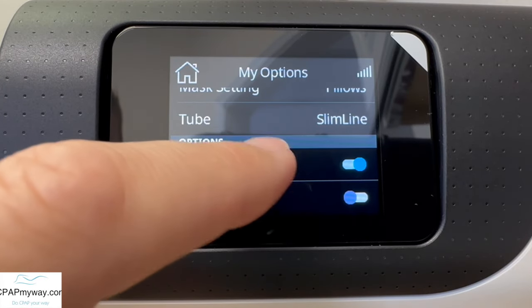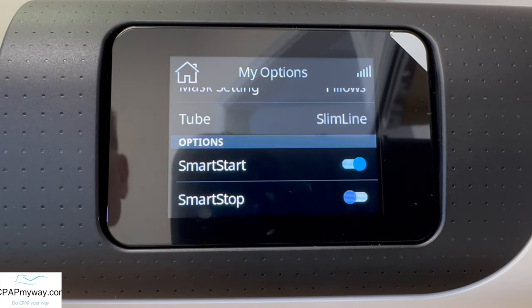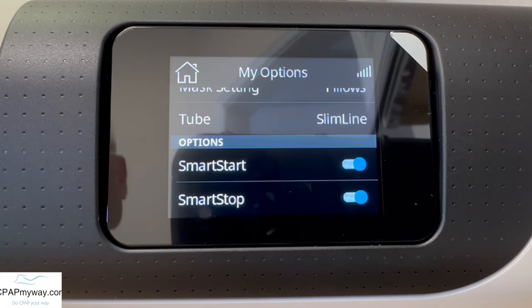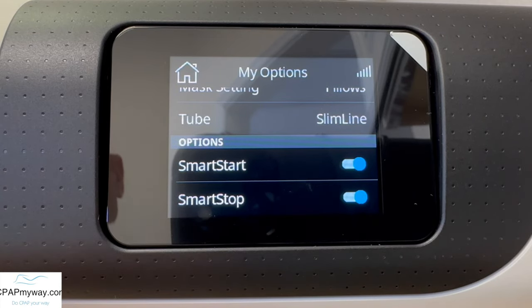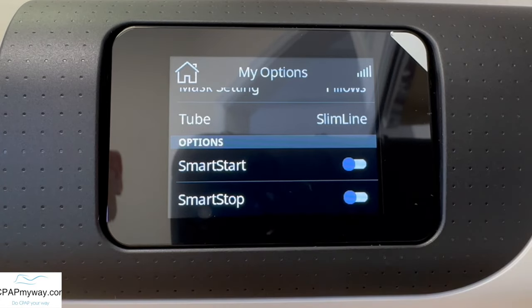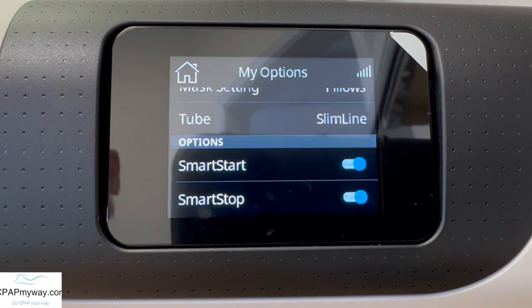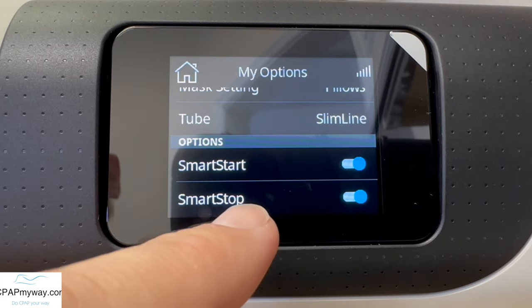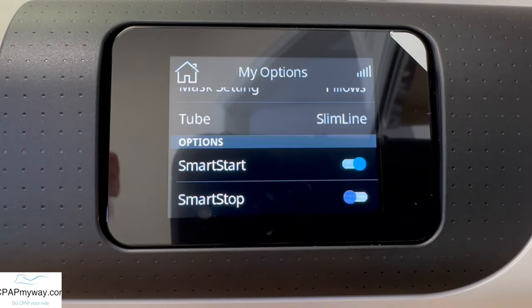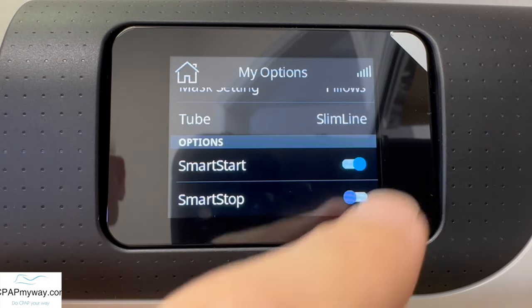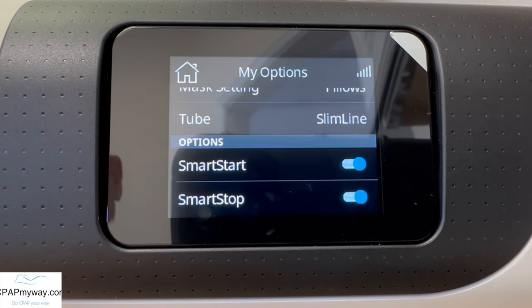Next is smart start. That allows the machine to start on its own when you start breathing on the mask. And smart stop does the exact opposite — when you stop using the CPAP and take the mask off, it'll turn itself off. If you want those automatic features disabled, turn them off. If you've had issues where you have high leaks and the machine turns itself off, sometimes you want to disable the smart stop. Most people do pretty well with leaving them both turned on.